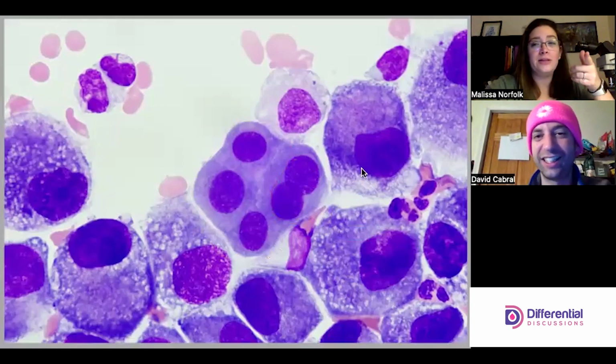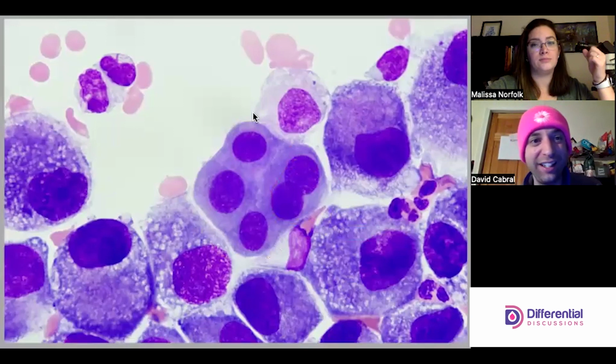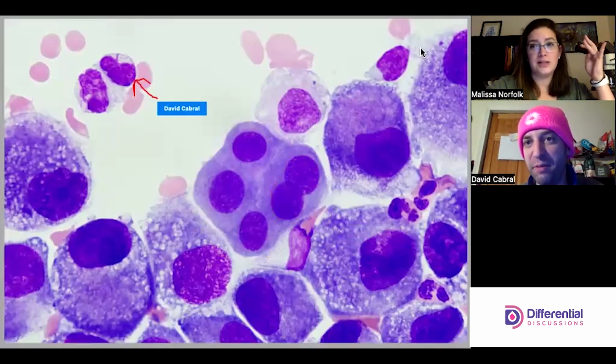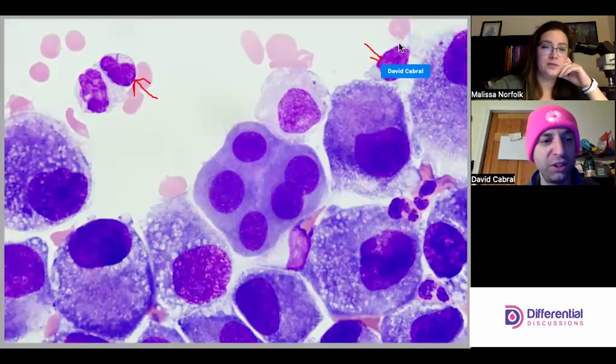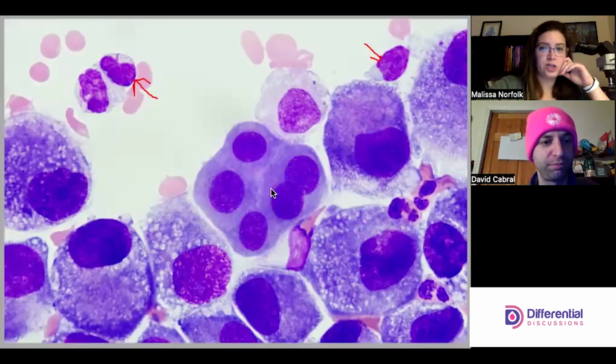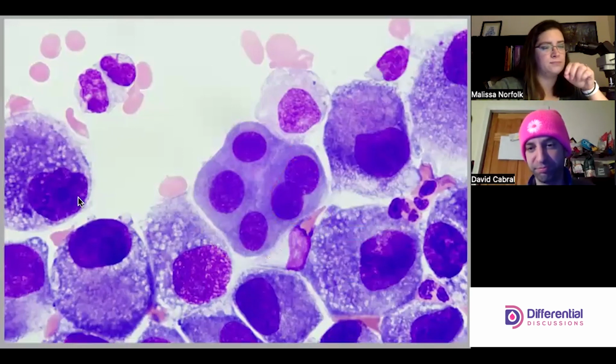The other thing too is next door is a macrophage. There's neutrophils, maybe a crappy-looking lymph, but there's a lot. There's maybe a better lymph over here too. What an awesome, total field to have. Beautiful. A juxtaposition with these really malignant, ugly-looking cells too.